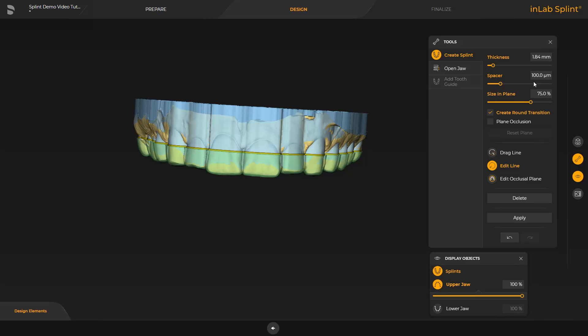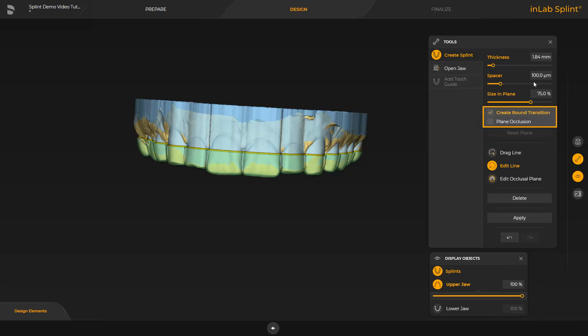At this point, different tools and options are available. To optimize the line, the currently enabled Edit Line tool can be used, or the Drag Line option above it can be selected. Additionally, we checked the Create Round Transition option so that the edges will be rounded. By enabling Plane Occlusion, a flat and plane occlusion will be created. To initiate the final splint calculation, we confirm again by tapping Apply.